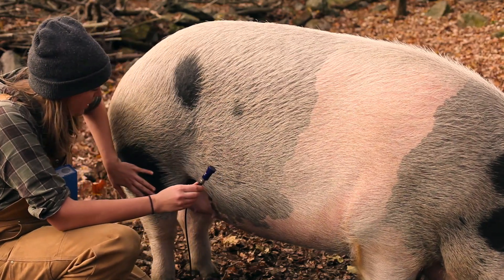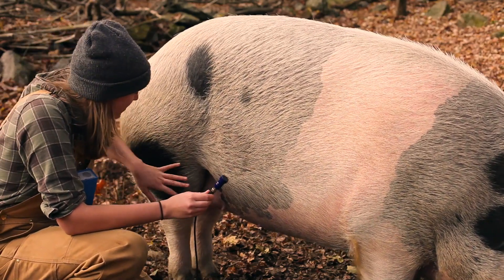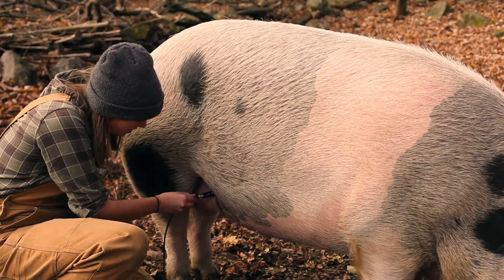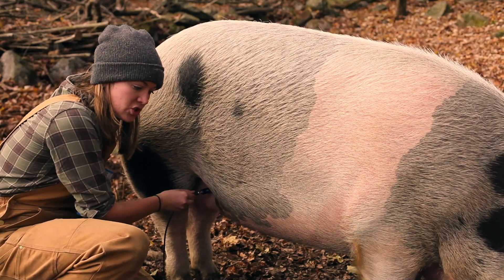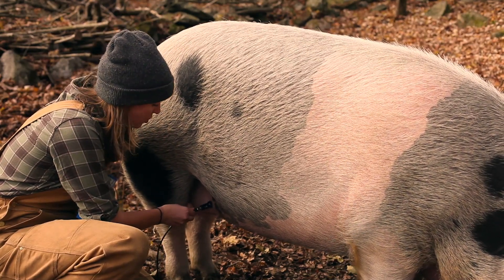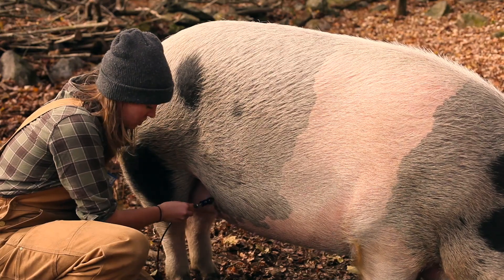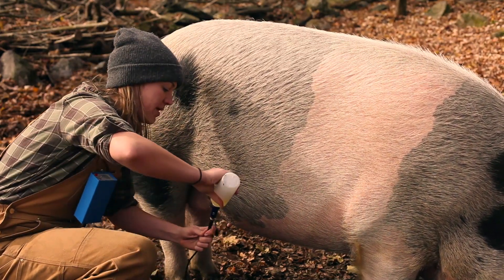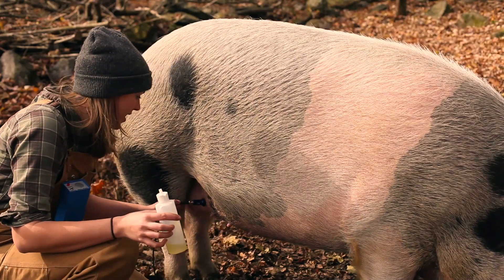You want to go on her right side, in front of her rear leg, and above her nipple. Once you hear some intermittent beeping, that's when you know that you have good contact. With her I've had to put a lot of oil on just to make good contact because she does have some hair.